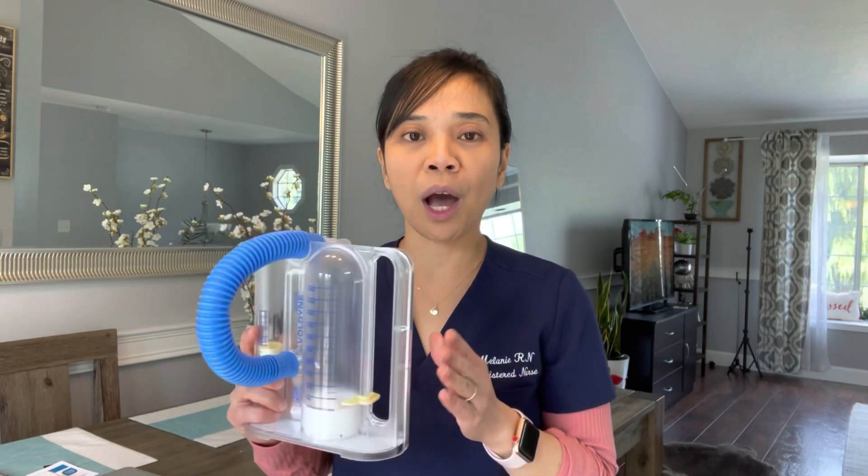We don't want those lung complications after surgery. And as a nurse, it is my responsibility to educate my patients and to show them how to use the incentive spirometer effectively.